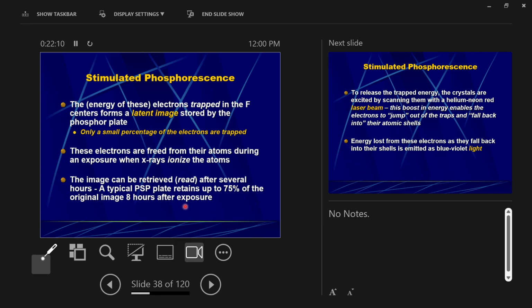And if any one of them needs to be redone, you find yourself grabbing new plates and running all the way back across the hospital to your same patient. Room to patients that can't go to the X-ray room, that's mobile radiography. Now, nowadays, mobile radiography is like DR, where on the mobile cart, your X-ray tube cart that you roll around the hospital, you have a plate that's connected to the cart, and when you make the X-ray, the image pops up on the cart. But before that, it was CR.